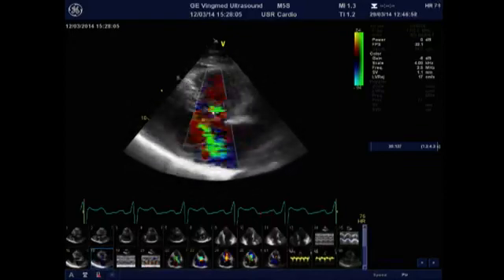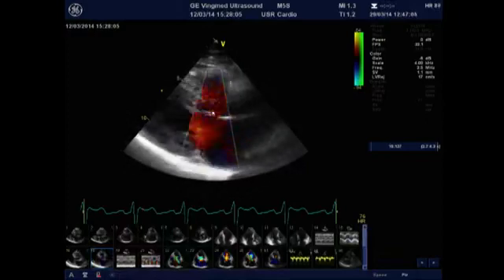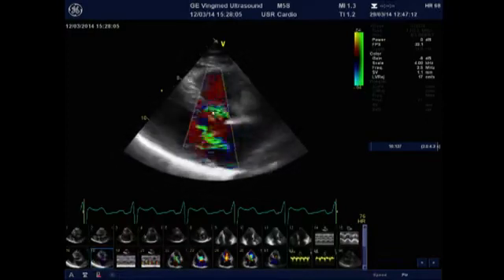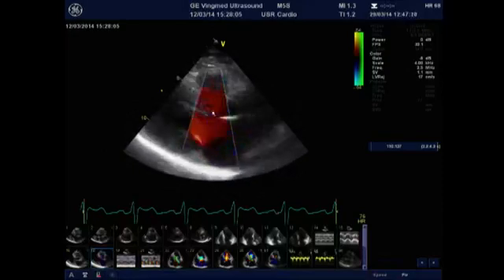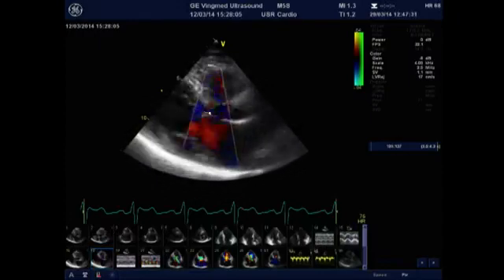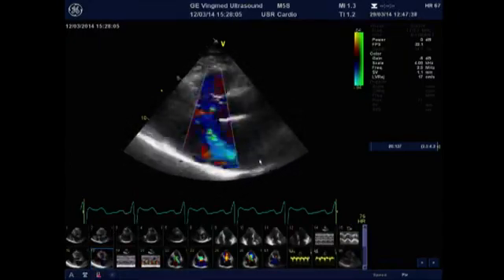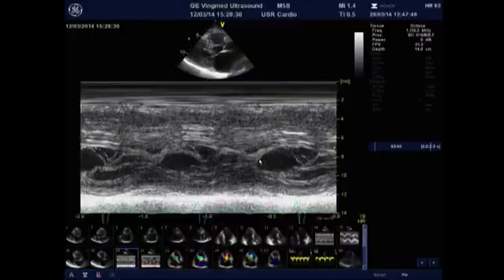We can see that there is also a mitral regurgitation to quantify according to the ACVI guidelines, perhaps moderate, but the most important thing is the direction of this mitral regurgitation. When it is SAM related to obstruction, its direction is posterior and lateral, showing that the mechanism of obstruction is SAM related. When the direction of the mitral regurgitant jet is central or anterior, we must always think of an associated organic valve disease.